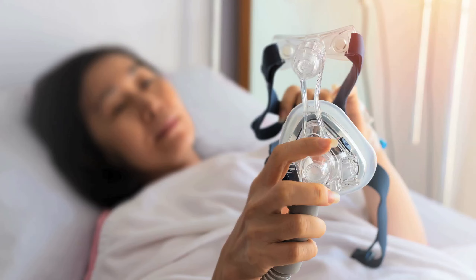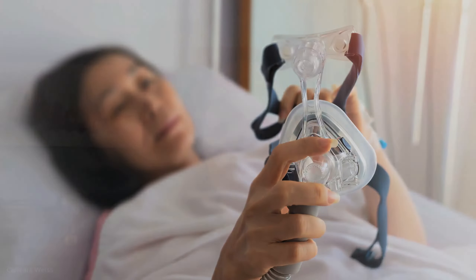You don't want to wake up the next morning with a mark because the CPAP is too tight, and you also don't want the mask to be loose on your face. So a good fitting is number one.